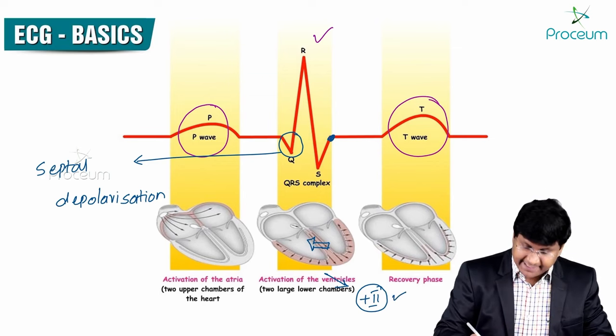So this session was only the basics: ECG paper, ECG machine, what the normal leads are, and how they should be placed. So please follow my subsequent ECG sessions about the abnormalities.